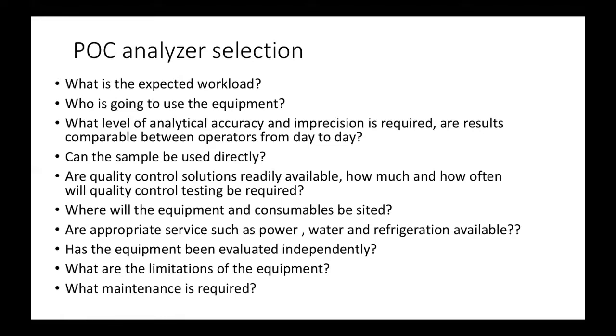And when you're selecting a point of care testing analyzer, see what your expected workload is. Who is going to use the equipment? What level of analytical accuracy or precision is required? Also see if multiple users are using the machine, whether results are comparable between operators, and whether some processing is required or the sample can be used directly. Then develop some quality control system also.